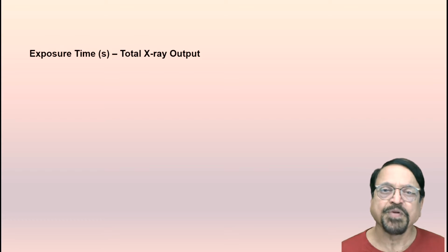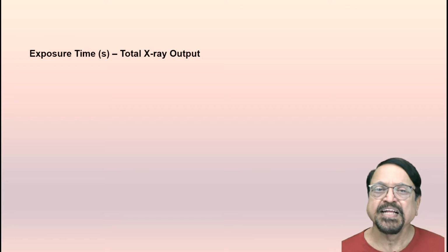There are certain things where we cannot stop the movement, like heart motion. So in all chest X-rays we try to use maximum MA and minimum seconds. So also in pediatric cases where they are crying or moving.